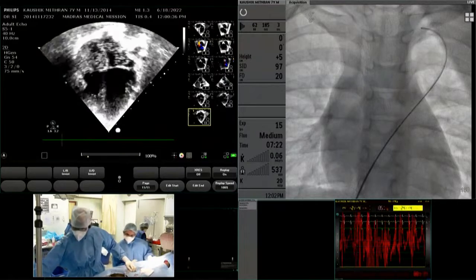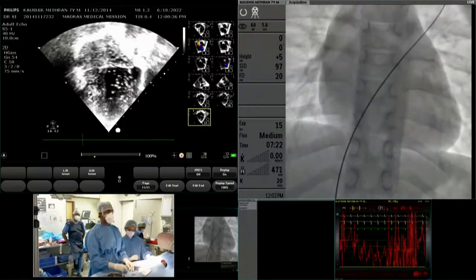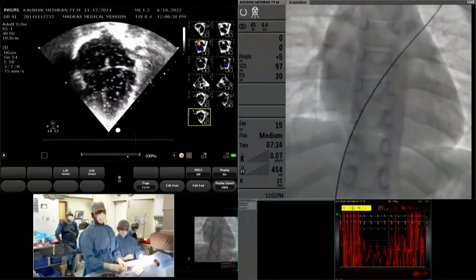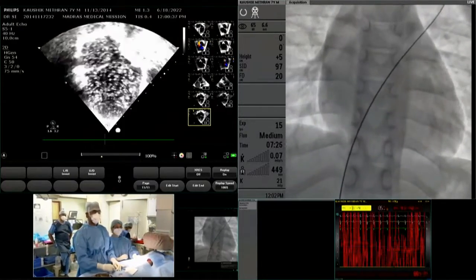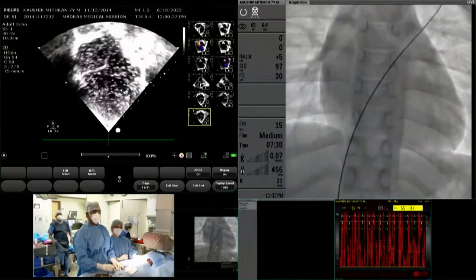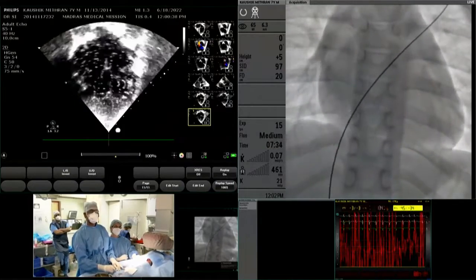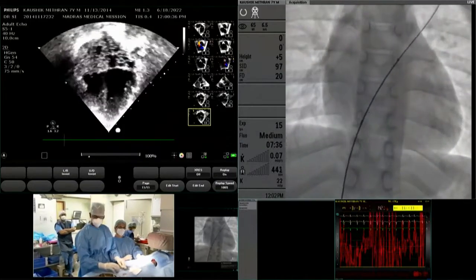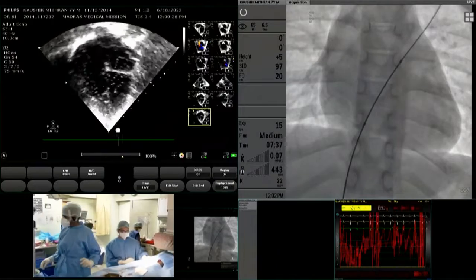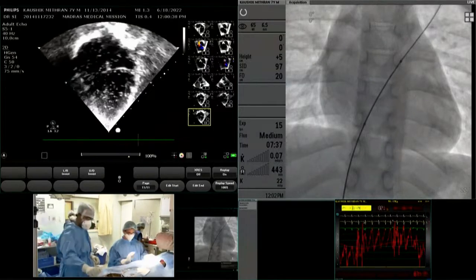Okay. No step up in the oxygen saturation from mixed vein to PA, but significant step down of 14% from the pulmonary vein to aorta. Only right to left shunting, no left right shunt. Get me a contrast. So while we are doing that, hemodynamics, so is doing.